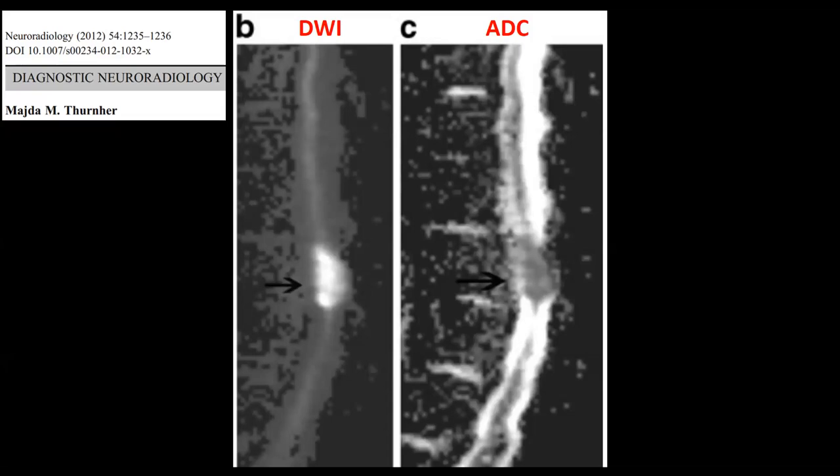Octavio, tell us. I would have included a very, very hypercellular tumor like lymphoma there, or maybe a drop met of one of those small blue cell tumors up there. Yeah. Okay. If hypercellular, when you see that light bulb, restricted diffusion, lymphoma has to be a differential diagnosis. Okay, I like that. Thank you, Octavio.